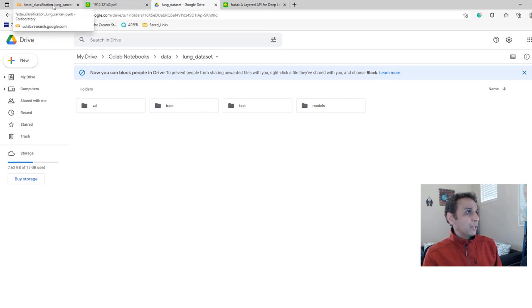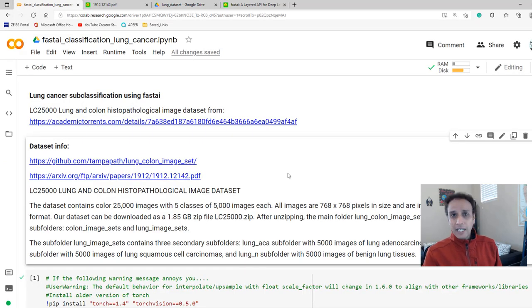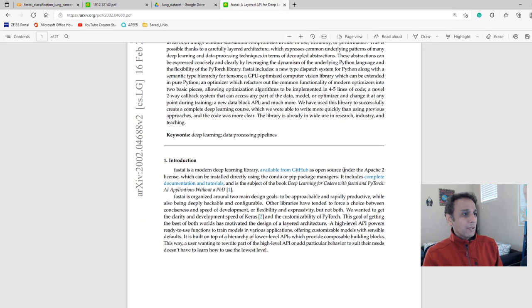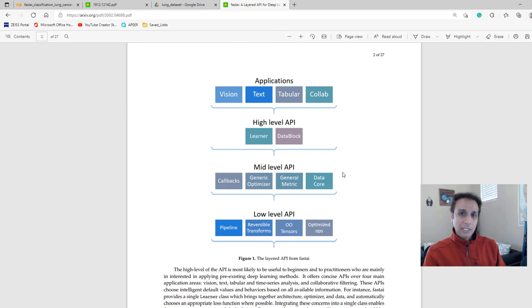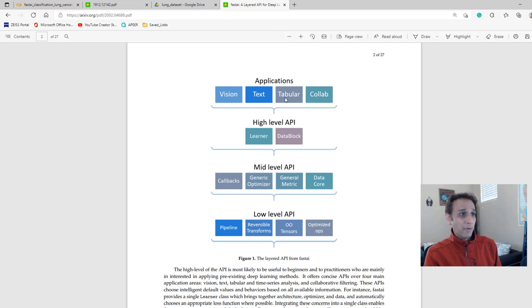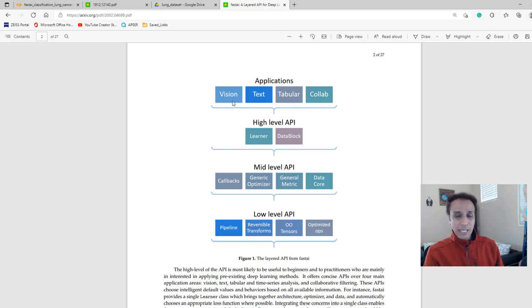Now let's get into the Fast AI API. There is a low-level, mid-level, high-level, and application-level API. It's very easy to interact with the application-level API because the tools are clearly separated into vision, text, tabular, and so on. We are going to focus on vision because this is an image classification task, and we'll look into the toolkit available as part of vision.